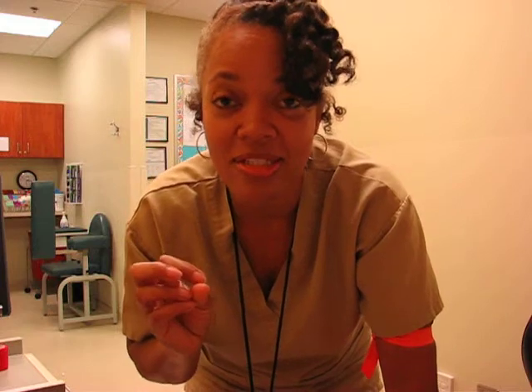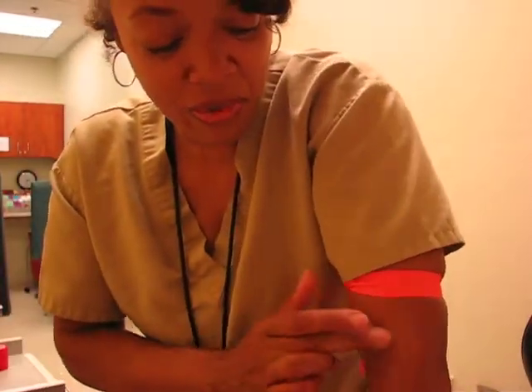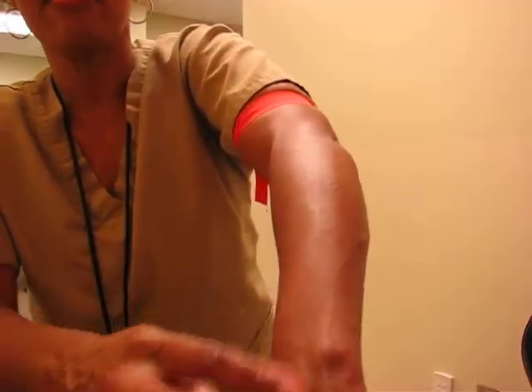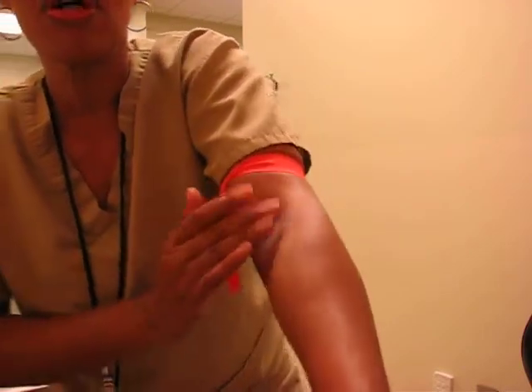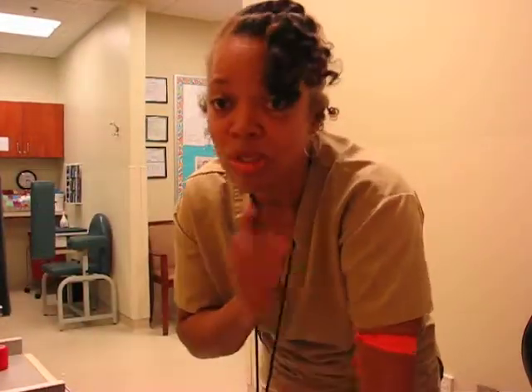Back to finding those hard veins. Once you apply that tourniquet, give it time. Time is of the essence — same principle when it comes to drawing blood. For a few seconds, maybe a minute. Apply the tourniquet. If it's a very hard patient, press — where do you think the veins are supposed to be? Where are the veins on you? Press and feel. Follow the veins from the hand. If they're very prominent in the hand but the patient doesn't want to be stuck there, follow those veins up. Press hard. You are going to feel veins you did not even know were there. Follow those veins all the way up and you will find a vein.